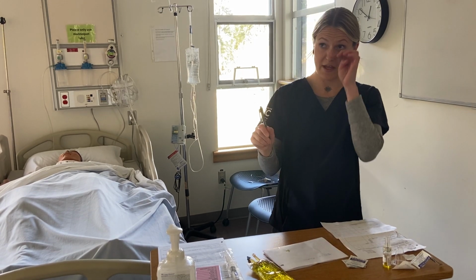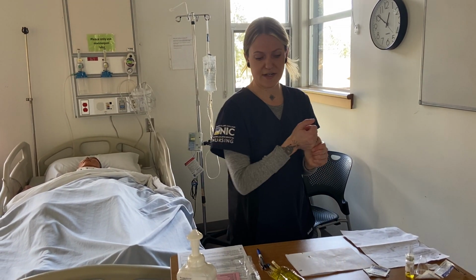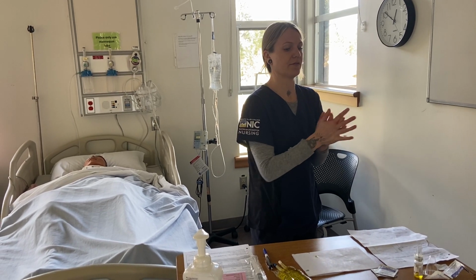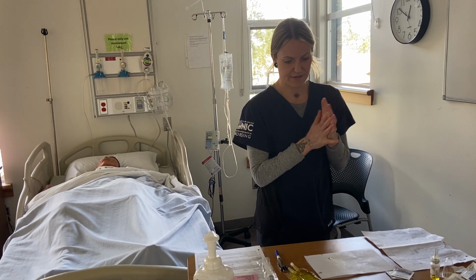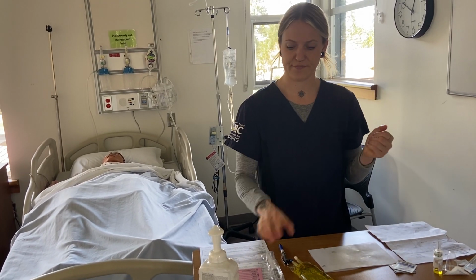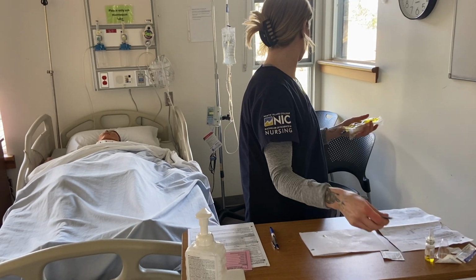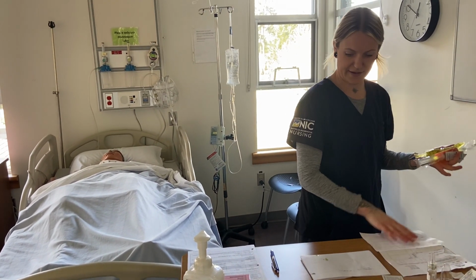So I will have to calculate that when I get into the room. I'll do another hand hygiene and then I'm ready to go to the bedside. Alcohol swab and my mark.